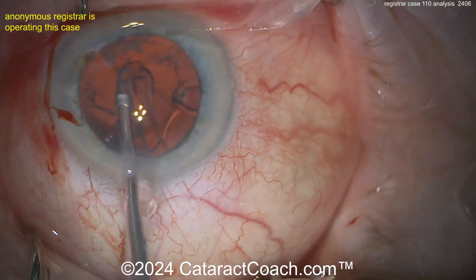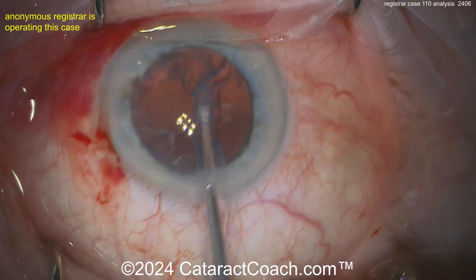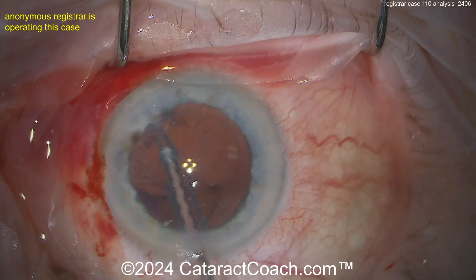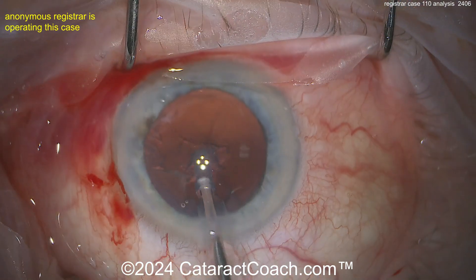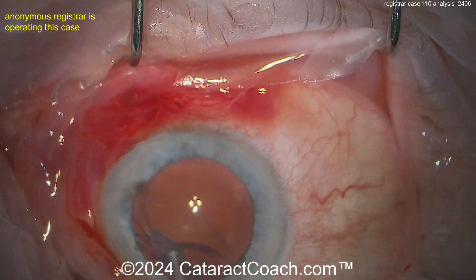If your main incision or your paracentesis is leaking a lot, that causes instability. You can fix this by increasing the infusion pressure — increasing the amount of fluid going into the eye to compensate for what's coming out. So in this situation I would not have taken the chopper out.